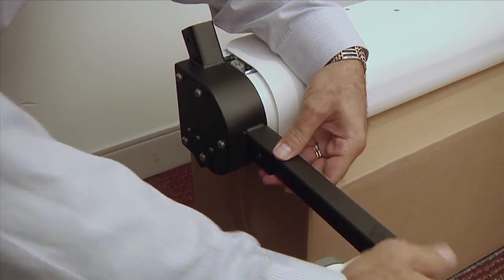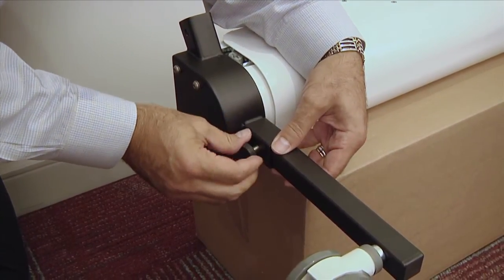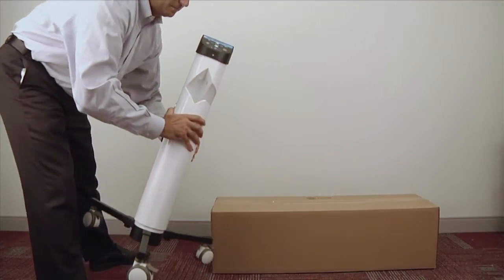Insert a leg on the base of the FlowMed and secure the leg with a thumb screw. Repeat these steps to mount the remaining legs, then place the FlowMed in an upright position.